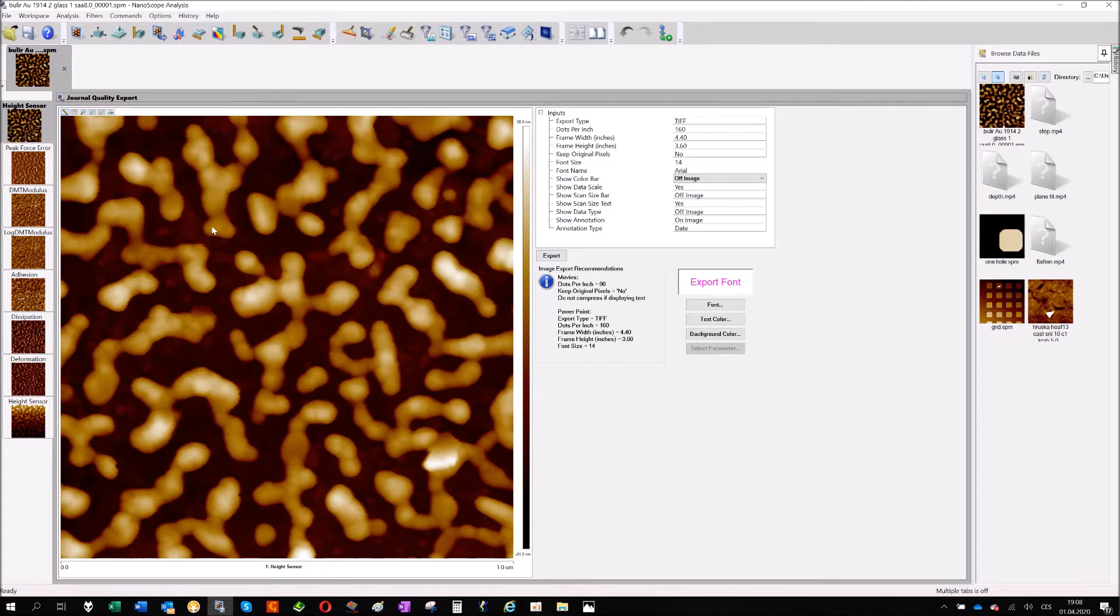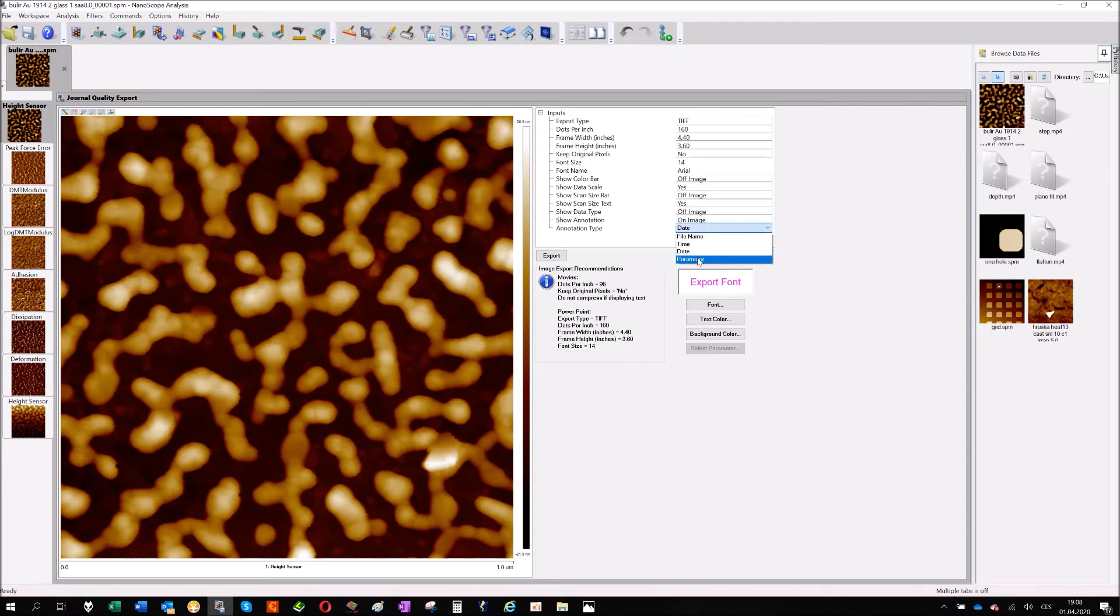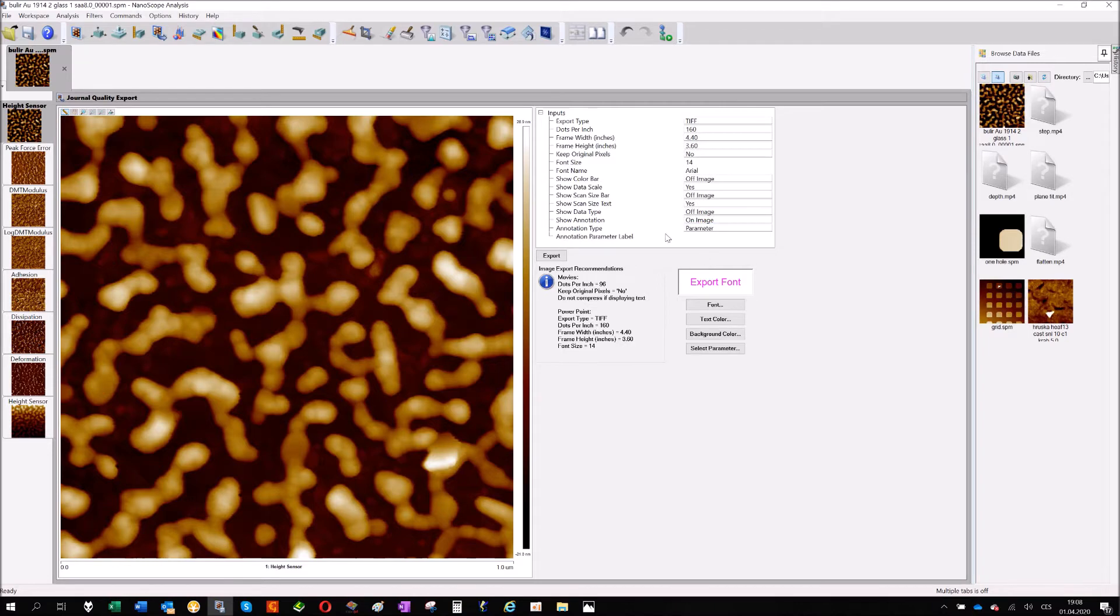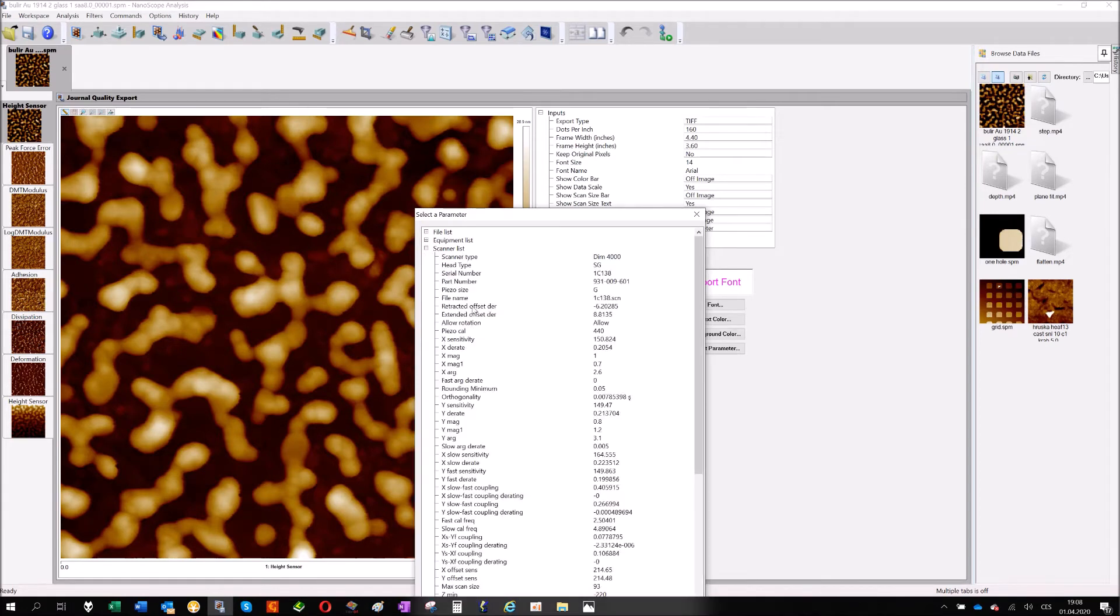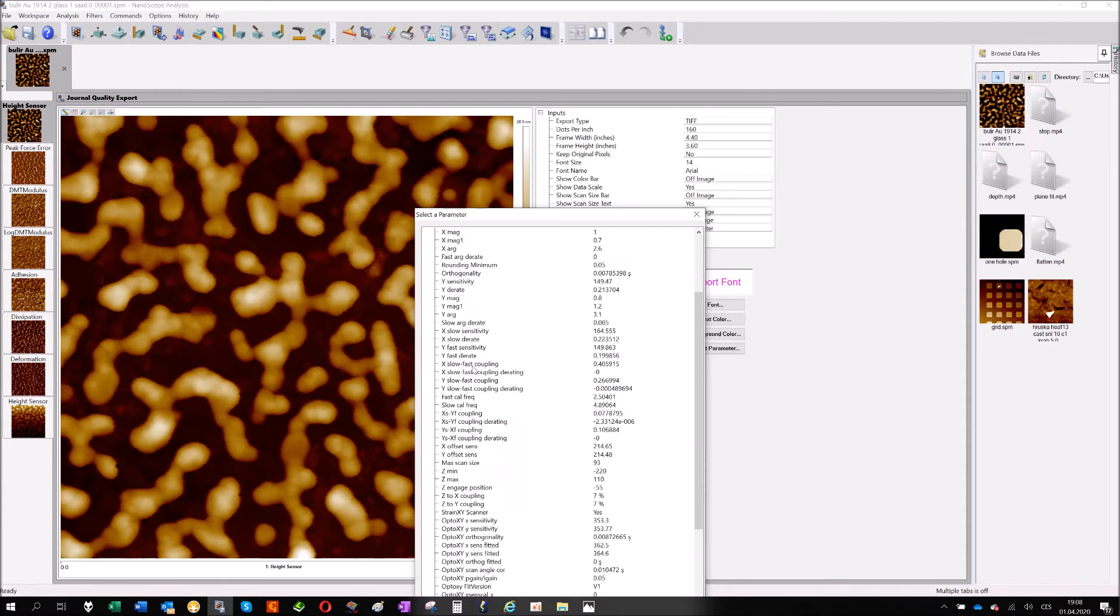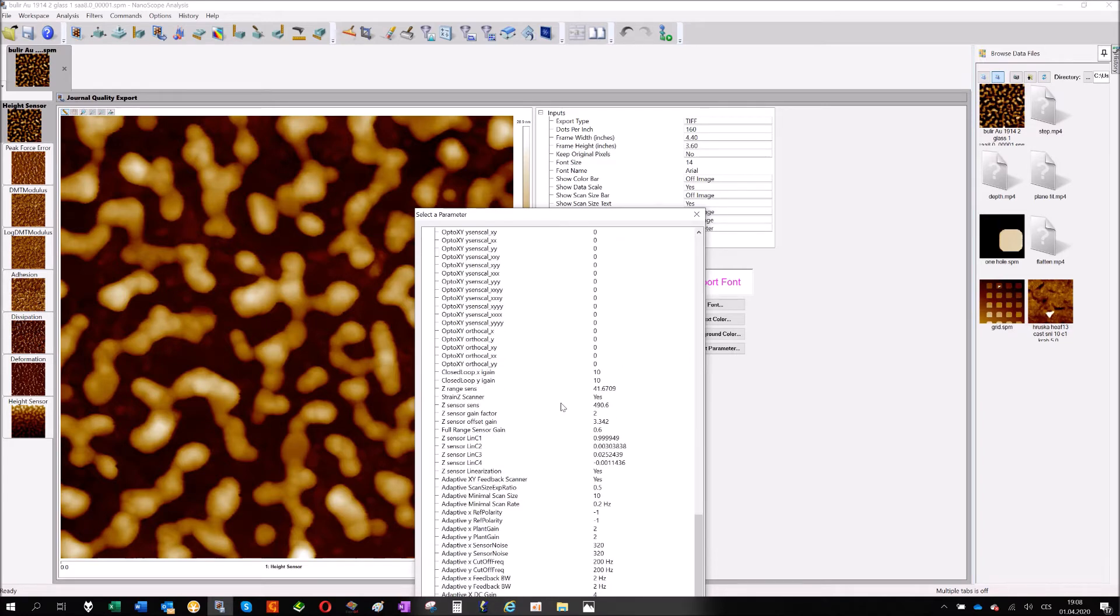Annotation, date, time, name, some parameters. The parameters, if I will show you, you can select it and it's a long list of parameters. For example, scanner, that's all scanner parameter files.